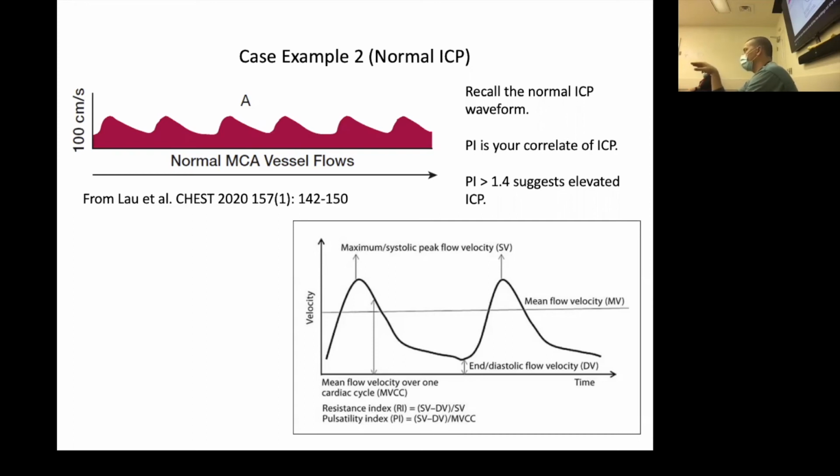But if you have a waveform that says I have high ICP, I must do one of two things. In fact, I must do two. One, I must act medically to decrease this ICP, and two, I must get neurosurgery on board to put in the appropriate monitor. No, granted, but that would be in the 15 to 60 range. So I'm trying to work out how you would pick that up. I understand when you lose the diastolic flow, but that's too late.